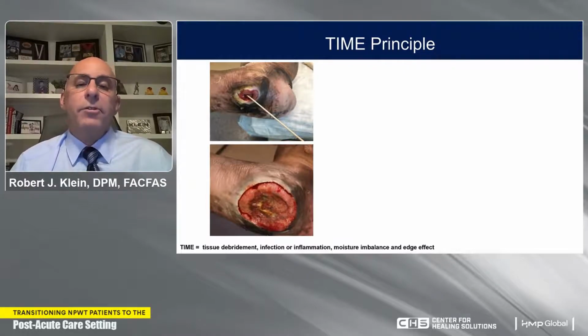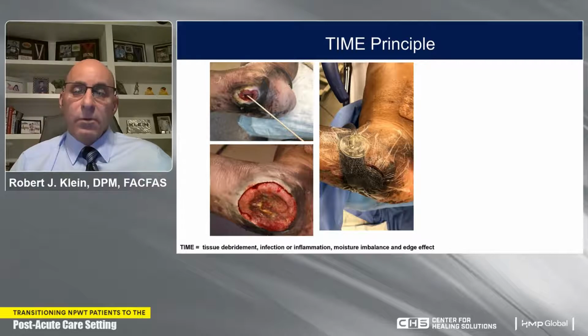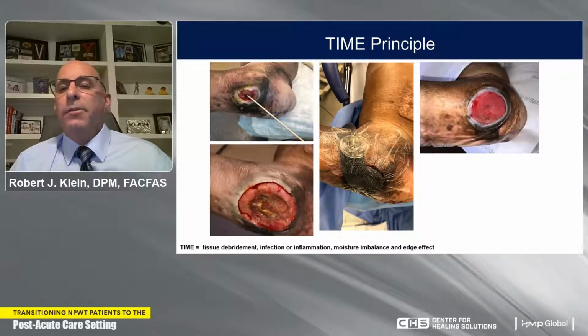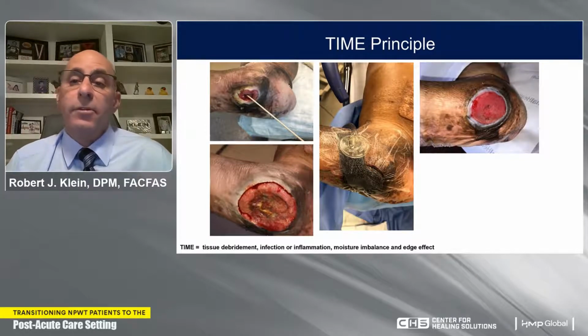So the patient was started on negative pressure wound therapy post-op day 1. We have the negative pressure wound therapy device on. We're getting both macro deformation and micro deformation of the wound. We're controlling that exudate by sucking on the wound, getting rid of that exudate, and we're getting contracture of the wound as well. You can see that both through macro deformation and micro deformation, we got granulation tissue that has formed and it's developed the skin line.